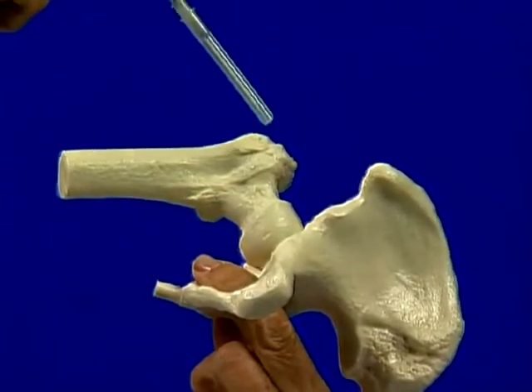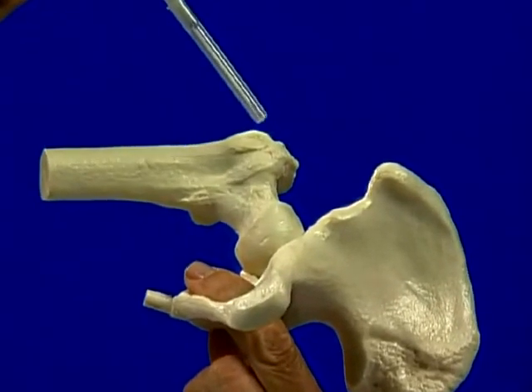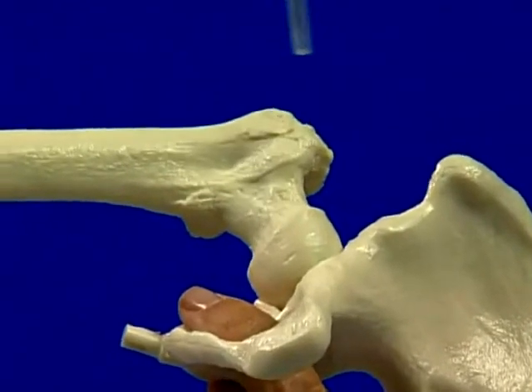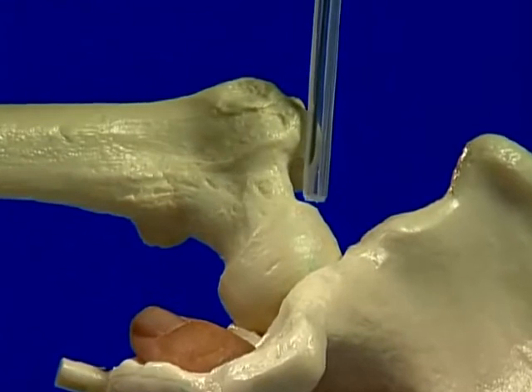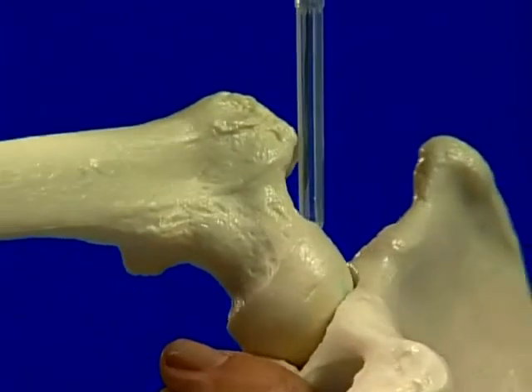Identify the greater trochanter. A good 2 fingers proximal to this lies the slope of the upper part of the trochanter. A long spinal needle inserted immediately proximally will pass down to touch the neck of femur. The needle tip will then lie within the capsule.